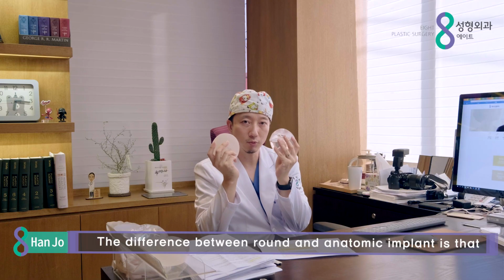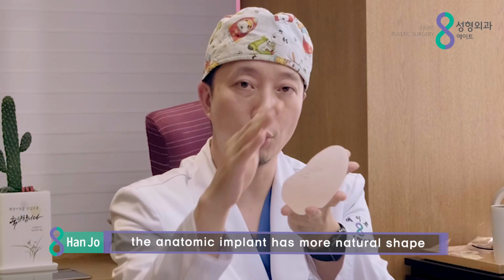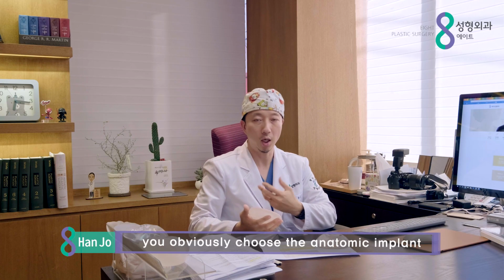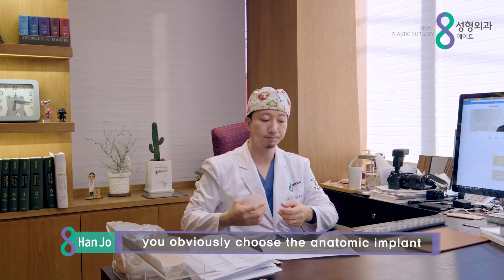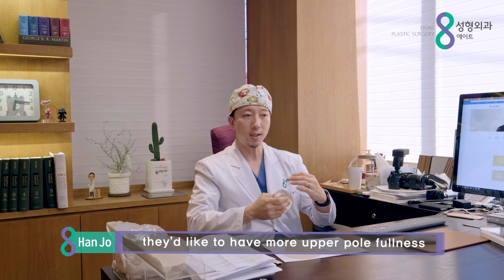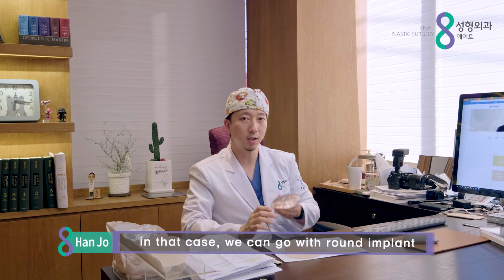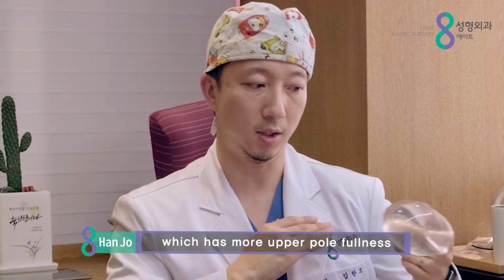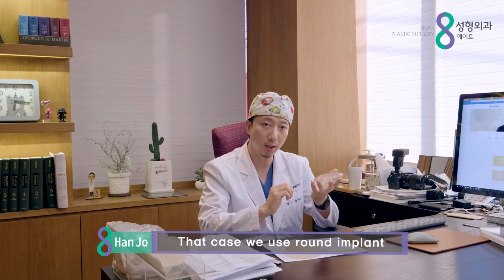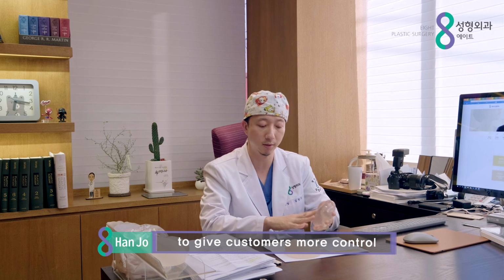The difference between round and anatomic implant is that the anatomic implant has a more natural shape. If you want a natural look, we'd obviously like to go with an anatomic implant. But the thing is, with Europeans and Americans, they like to have more of an upper pole fullness rather than having more naturalness. In that case, we can go with round implants, which has a more upper pole fullness and also is more soft to the touch. So in that case, we'll use round implants to get more of a contour that the patient likes.